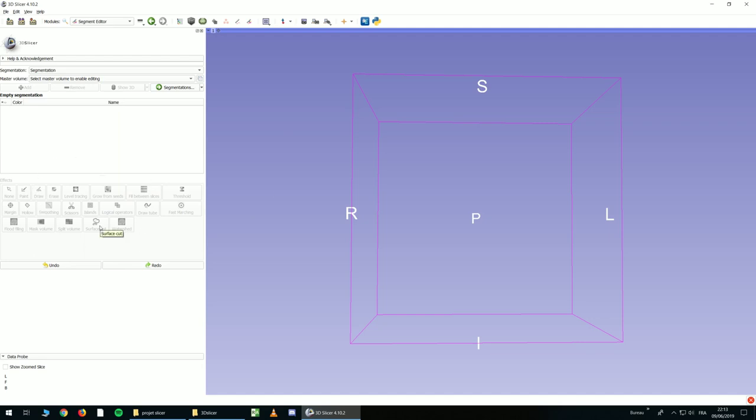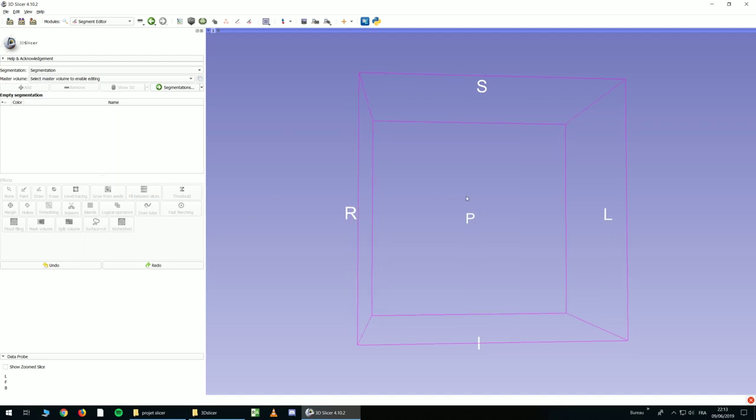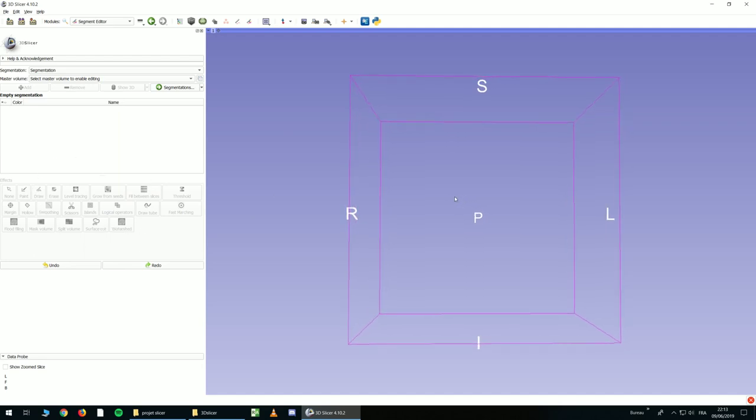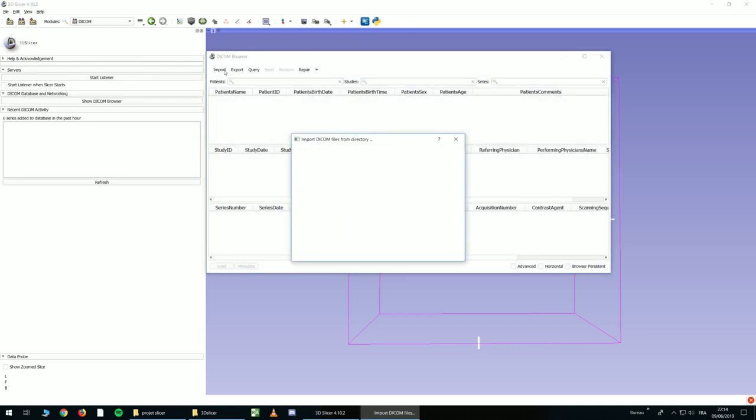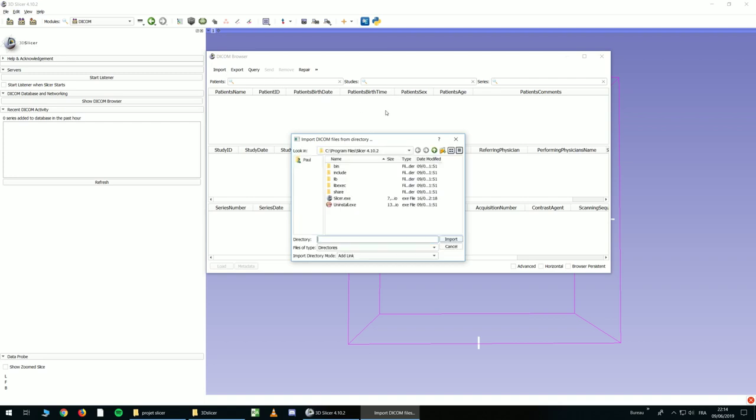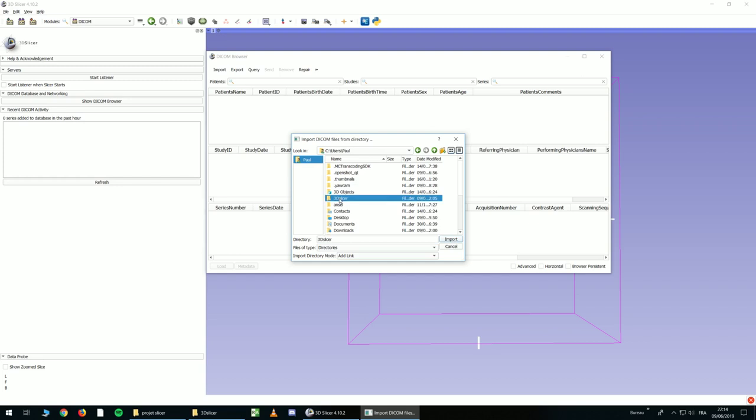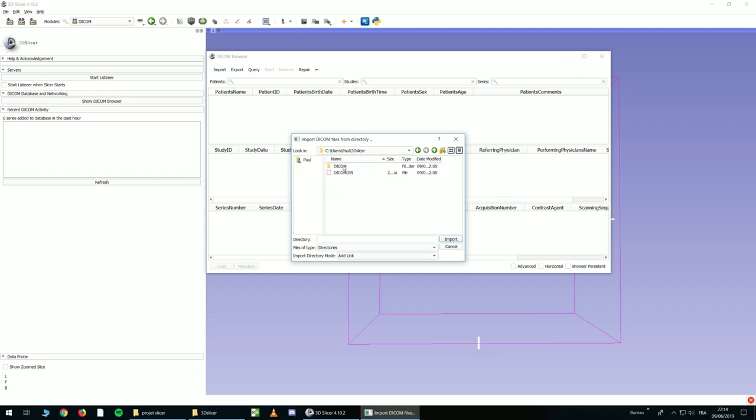And now it's time to load a CT scan. So you click here on DICOM and import. And you choose the folder. It's named DICOM because I used Anonymizer. And you click Import, and you just have to wait a few seconds.